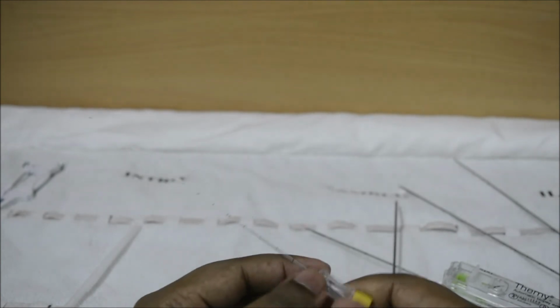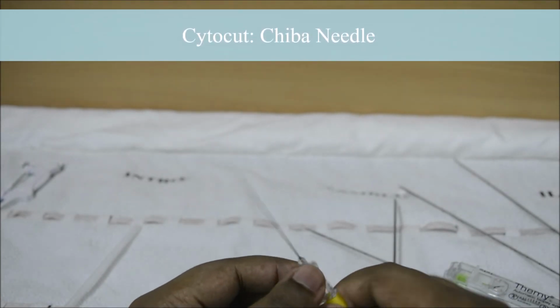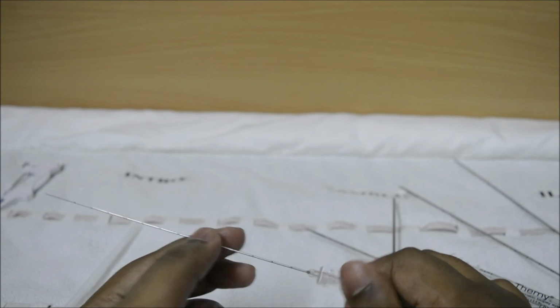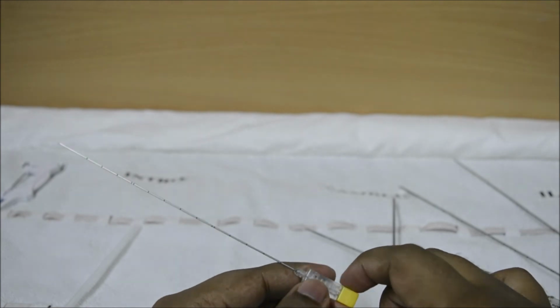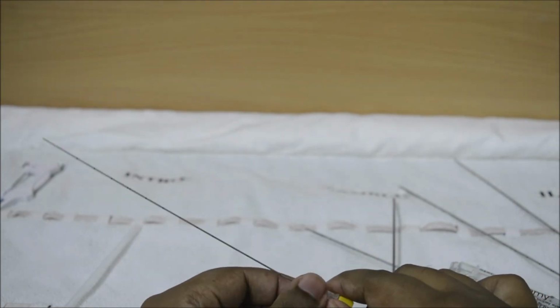The last type of needle which we have is a cytocut needle, which is used to perform FNAC. The full form of FNAC is fine needle aspiration cytology, and this kind of needle is traditionally, in colloquial terms, called the Chiba needle. So if anyone asks you what is a Chiba needle, you can refer to the cytocut needle of MDL.